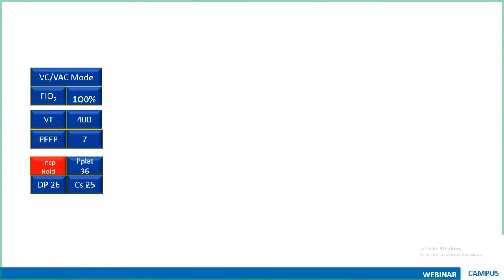Low compliance means it is high elastance. So this is the H group. Okay, so forget about the other things. Here you have to definitely increase the PEEP. Now, I've kept other settings at I:E ratio 1:2, respiratory rate 18, etc.